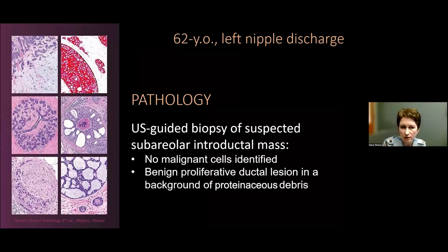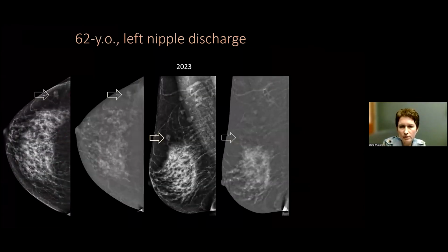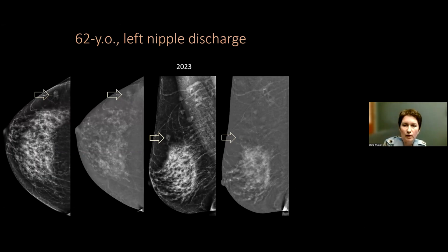Let's say you're stuck doing some CEM cases and you think that MRI might solve your issues. Not always does, or not even often does, because it might have just the same pattern and the same issues as contrast enhanced mammography. And here's an example of how you can use your contrast enhanced mammography, especially the lower energy part of it, in relation to the prior images.